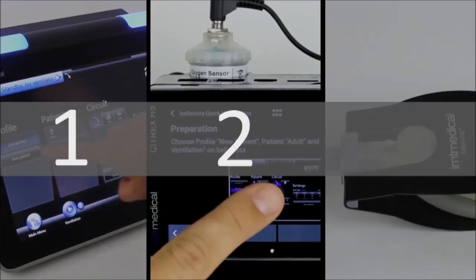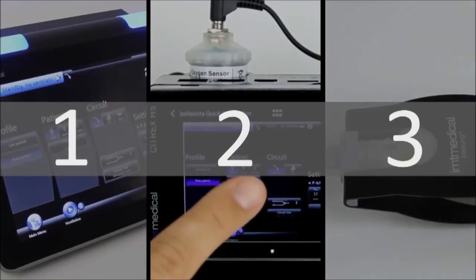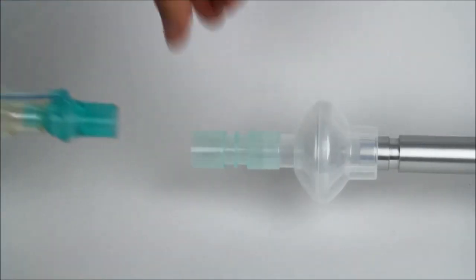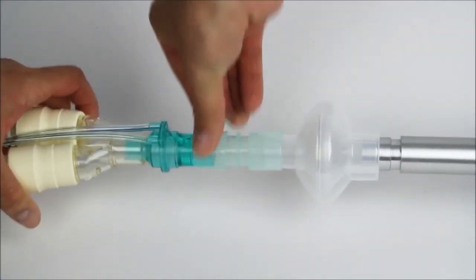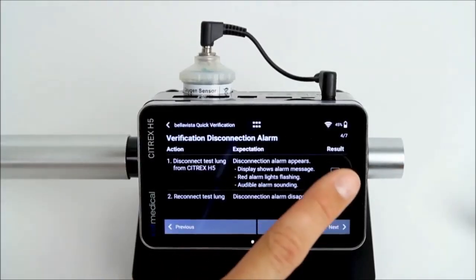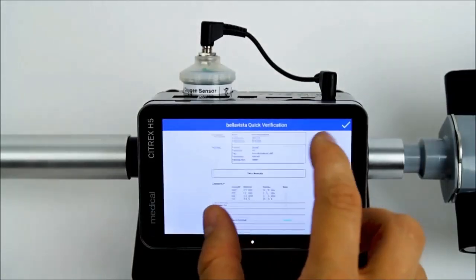The app guides you through the following three simple steps. First, connect the Citrix H5 to a ventilator. Second, perform verification. And finally, generate a test report.